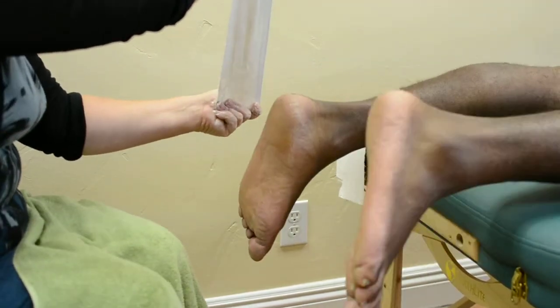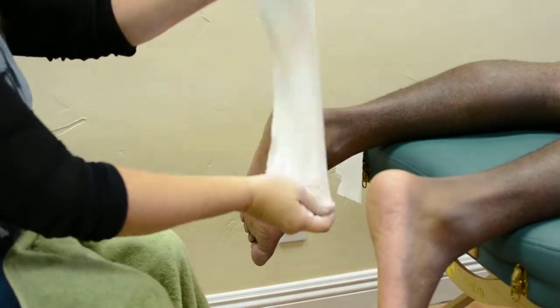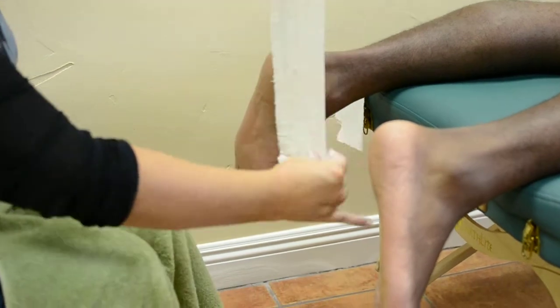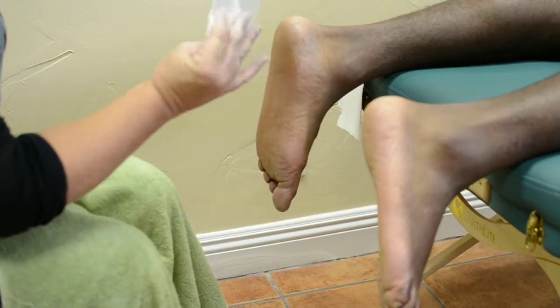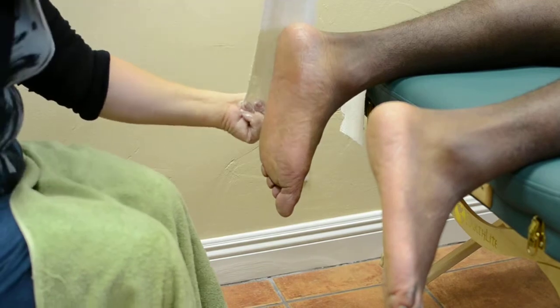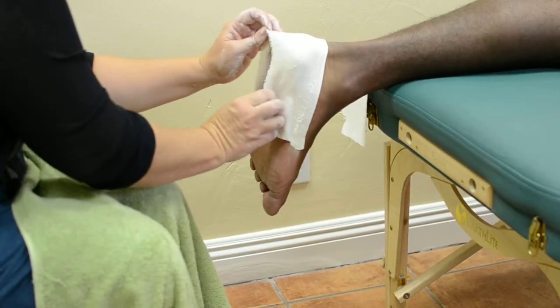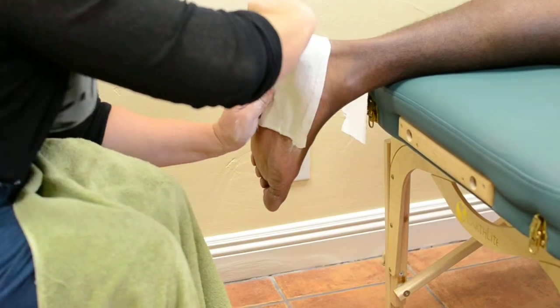Oh, really? Jacksonville. Okay. So I squeezed out as much of the water as I could, and then I just kind of run my fingers over the plaster to fill in all the little pores so it's smooth. And then I fold a little quarter inch over the top to reinforce it, because obviously once these slipper casts come to the lab, we're going to be pouring liquid plaster into this slipper cast. So we just want to make sure that it doesn't collapse at all.